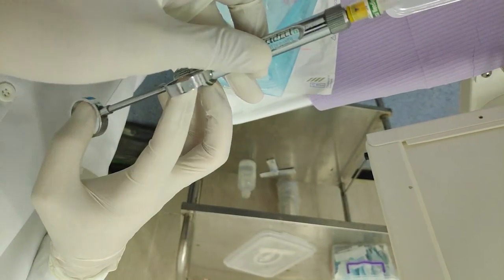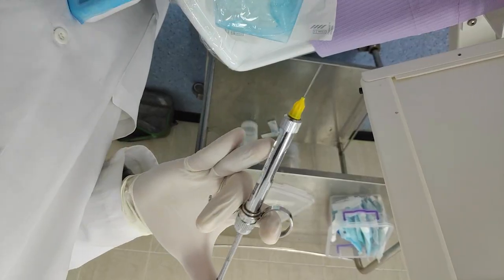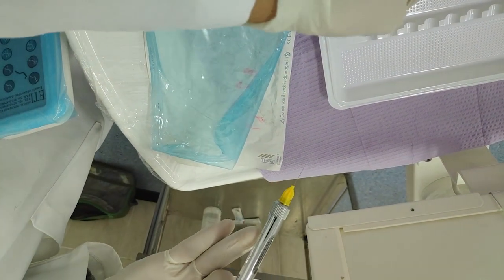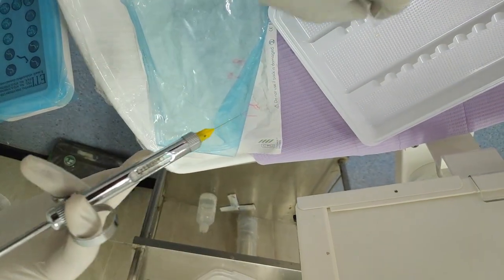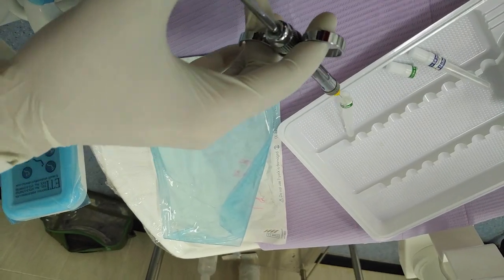We make sure the needle is put in the right way and the liquid comes out. The needle should not be bent. When we want to recap the needle, we should use the one-hand scoop technique to make sure we are not getting injured.